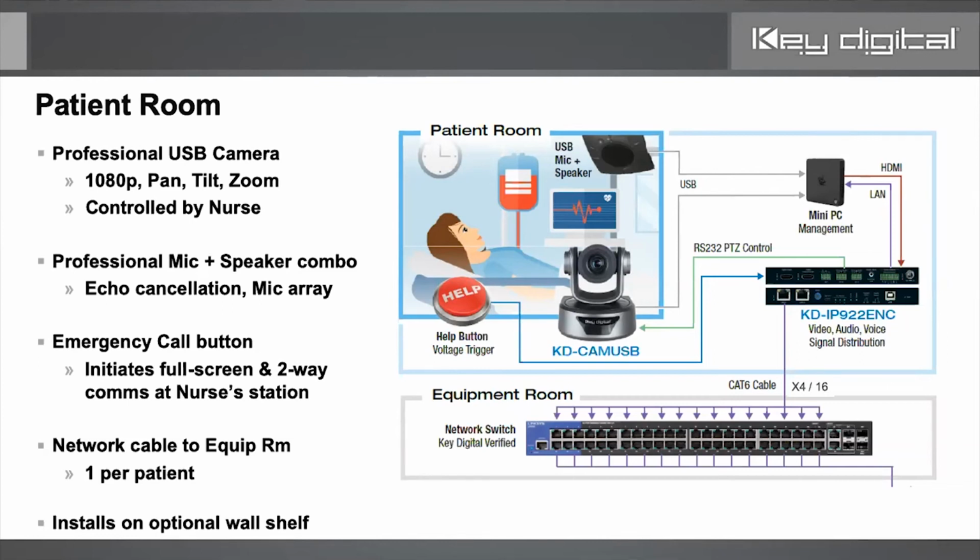We're happy to look into customized jobs for that, because some of our clients asked whether or not they could drive certain medical devices through this that do have USB out, and whether or not we can replicate that data on the opposite side with the nursing station. To be honest, I'm not clear on the answer on that, but my understanding is as long as the bandwidth requirements are within the range, it should be okay. But you could check with us on that.